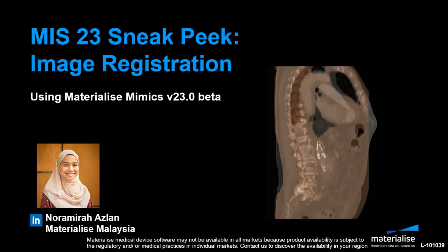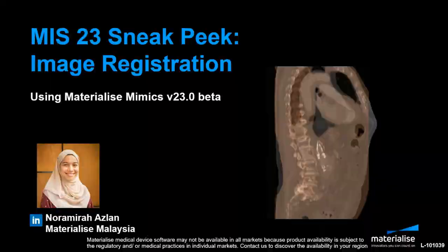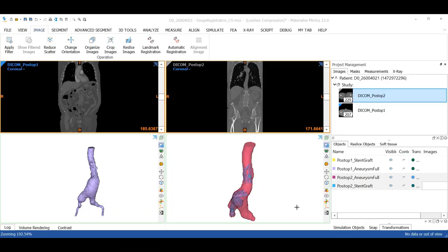In this video, we'll be looking at two different post-operative aneurysm data and register them together starting with the images. All right, so what we see here is the beta version of MIMICS 23 and the two set of images of the post-op aneurysm taken at different time points together with their respective 3D models.